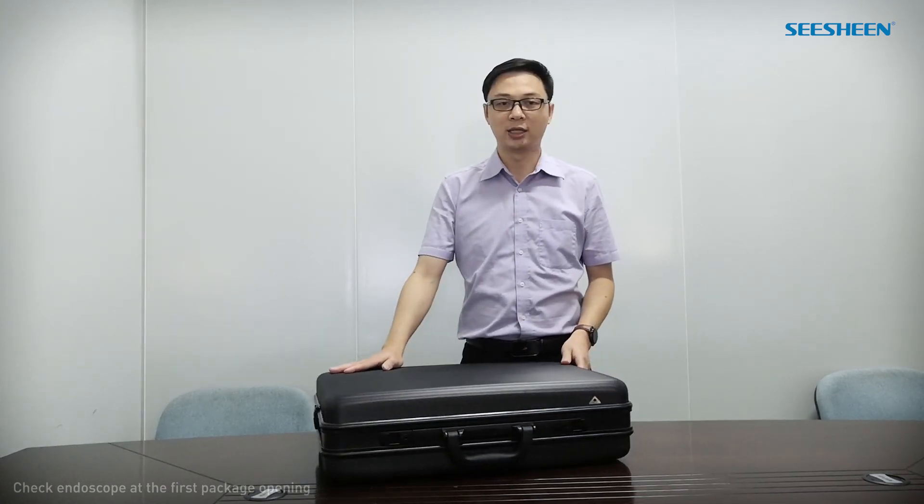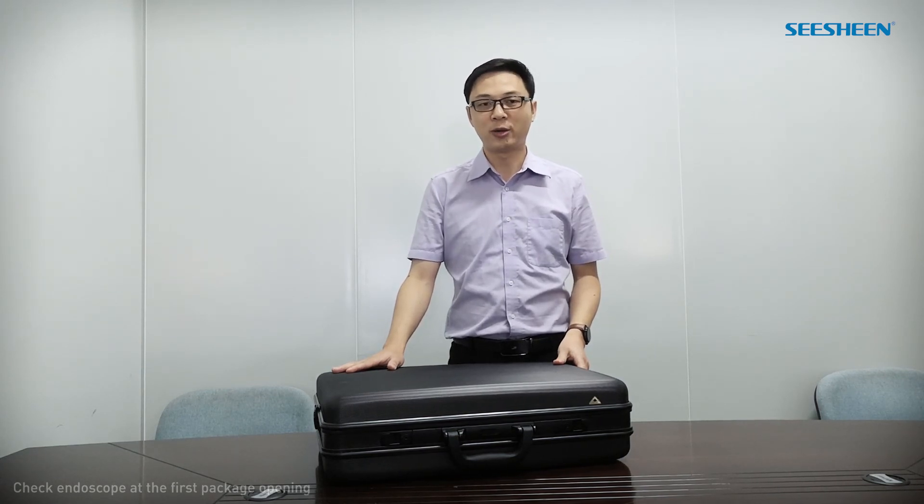Hello, this video is to instruct how to check the endoscope at the first package opening. After you receive the endoscope, please open the suitcase and check the endoscope according to the packing list and test all functions, to make sure they are in good condition and functional after a long transportation.